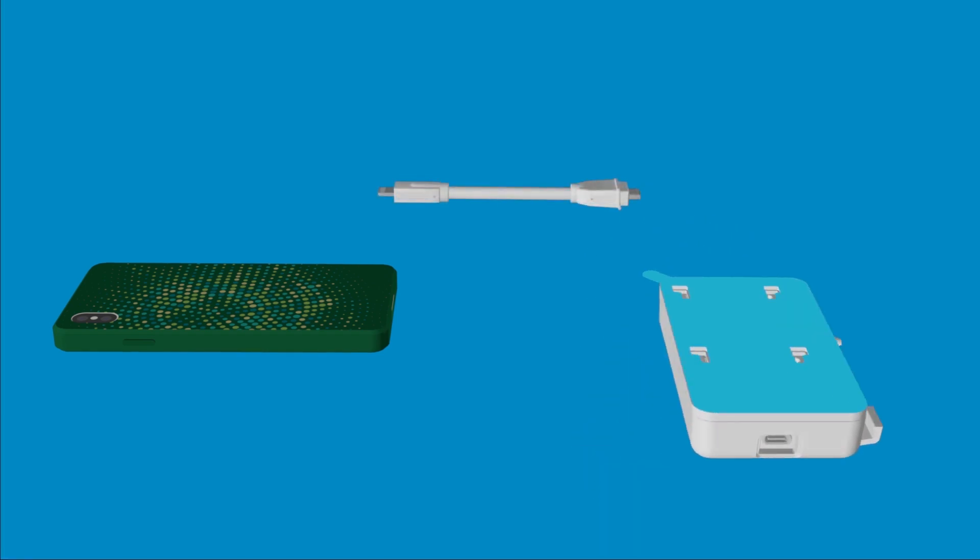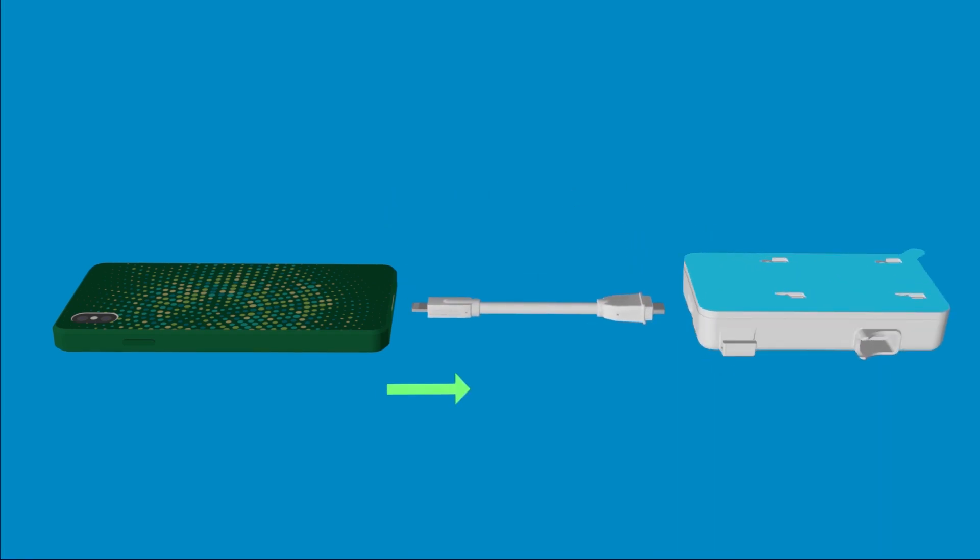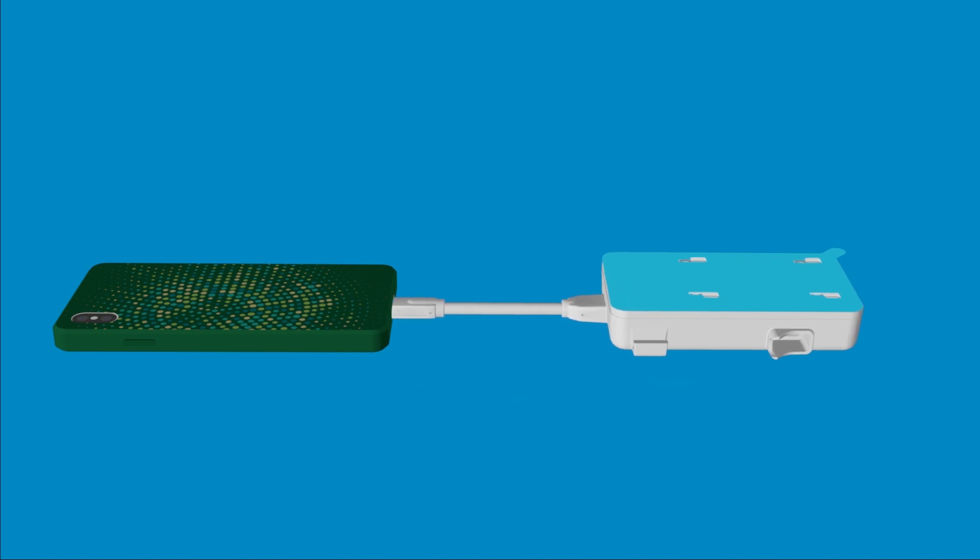Next, insert the USB-C end of the flexible cable into the bottom port of the Lumify power module, and the lightning connector of the cable into the iOS device port.